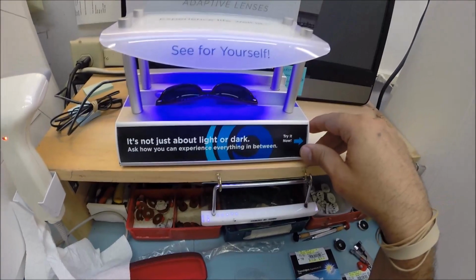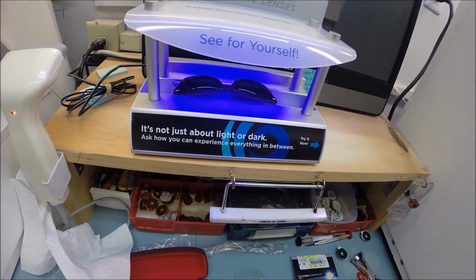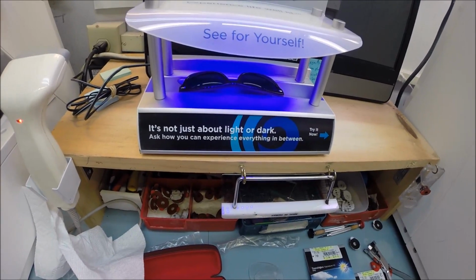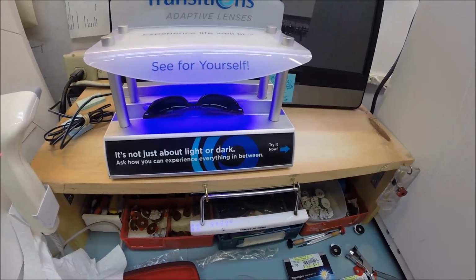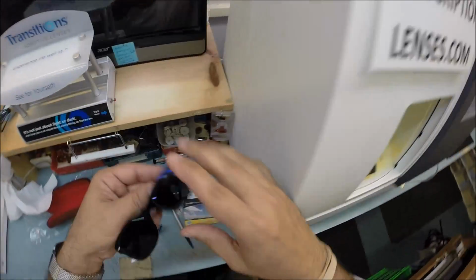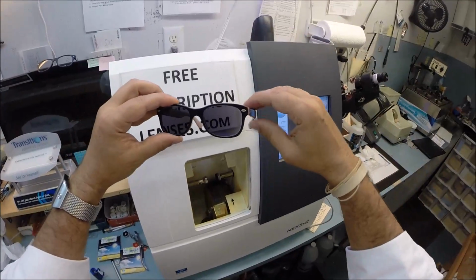And all transition lenses will turn dark on day 1. Give them 2 weeks of exposure to the sun, and they're going to continue to darken every day for the first 2 weeks until they reach their final setting. After that, they'll work for years with maximum performance. Now, the only time they won't work is if you're inside of a car. The windshield has UV protection to stop your dashboard from cracking or your upholstery from rotting from sitting in the sun all day. But that's what they look like the first time they've been activated.